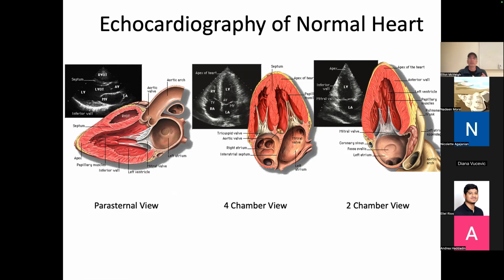So essentially, when you want to show a physician results of your imaging technique in the heart, you want to first show them those results in these views because they know these views very well. They've been looking at them for 50 years, right?